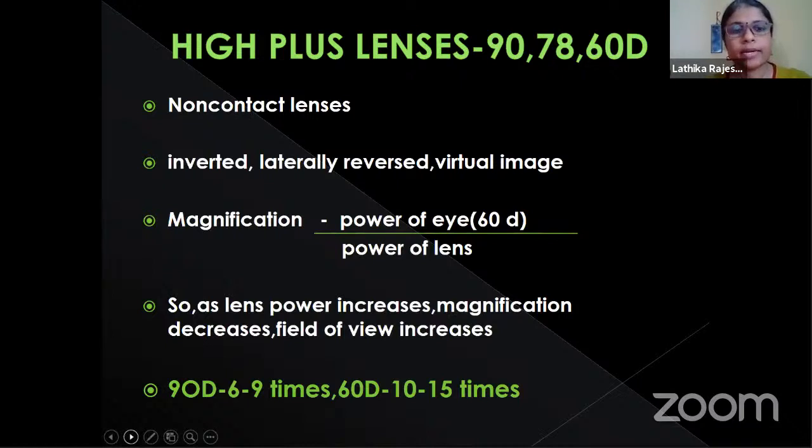To give an example, every day you look at the mirror, what you see is a laterally reversed virtual image. But imagine yourself upside down, standing head on heels. That is how the inverted aspect also comes along in these plus lenses.